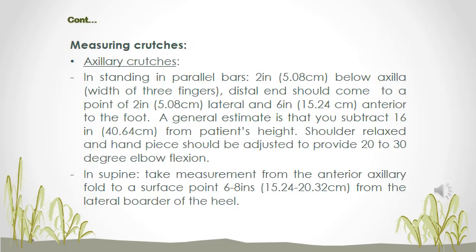How to measure crutches to fit your patient's body specifics. First, axillary crutches. They can be measured either in standing or when your patient is lying in supine, on their back, facing up.